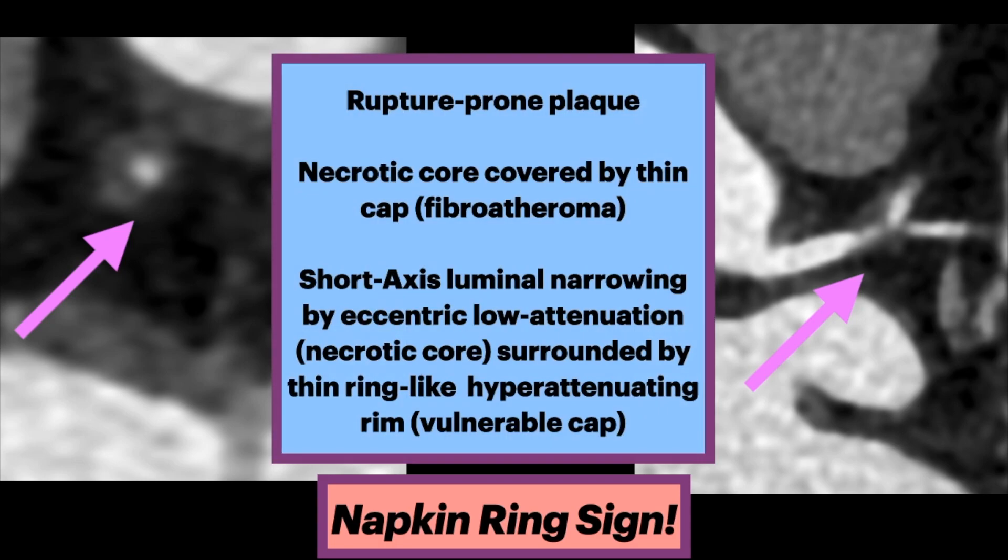It is a rupture-prone plaque, comprising a necrotic core covered by a thin cap, a.k.a. the fibroatheroma. In short axis, there is luminal narrowing by eccentric low attenuation necrotic core, surrounded by a thin, ring-like hyperattenuating rim — the vulnerable cap.